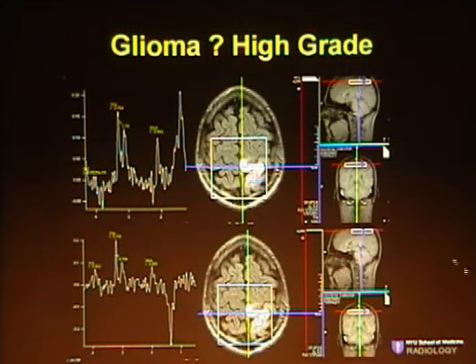So I want to ask you whether you think this is normal or abnormal lipid. Who thinks this is abnormal lipid in the tumor itself? Okay, who thinks this could be normal lipid from somewhere else? Okay, so there is some controversy and some disagreement in the audience.